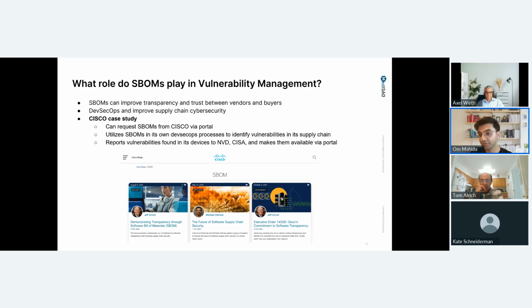They themselves are a really good example to follow of how a large organization is being very efficient in their implementation of SBOM adoption. As a buyer, you can request SBOMs from Cisco via the portal, which makes it accessible. If you need that SBOM, you can directly ask for it and request it through a very clear process, instead of having to ask around and getting caught up in legal or process complications. Additionally, they're adopting SBOMs internally to improve the security of their software and devices. They include it in their DevSecOps processes.